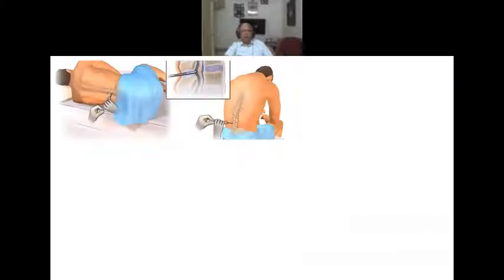Just a quick clue for all the junior students who have not had an opportunity so far to see how a prostate surgery is performed. I thought I will go through the steps. First, you give a spinal, either in the lateral position, but preferably in the sitting position, especially for the elderly who don't have to bend down, and sitting makes it easier for both you as well as the patient. Try to go as low as possible and give a spinal.